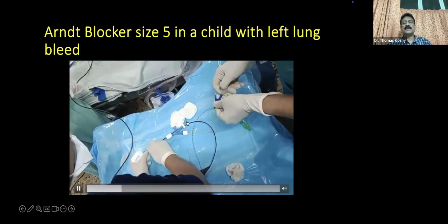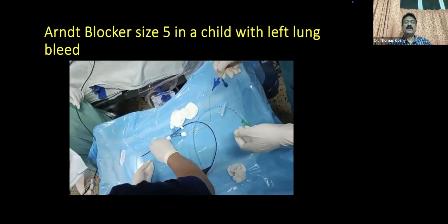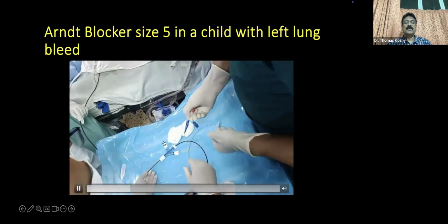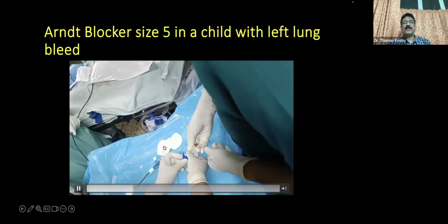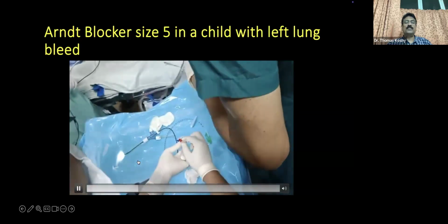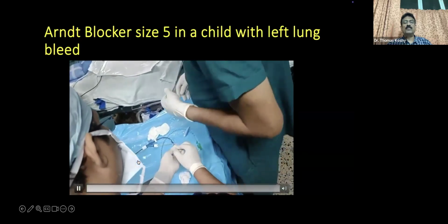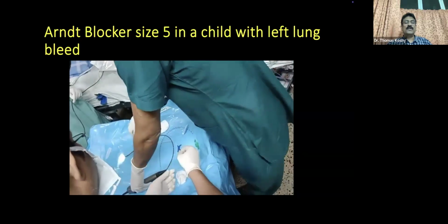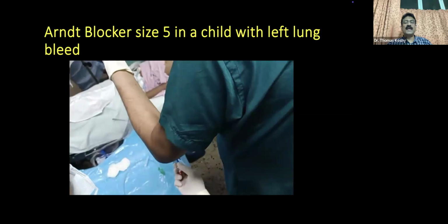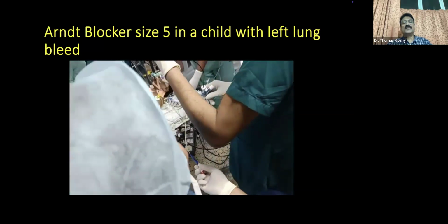This is the FOB, a size 2.8 FOB from Karl Storz. And this port is for connecting the circuit for ventilation. And that is a balloon. There is a wire loop tip. Through the wire loop, we will put the FOB and direct the balloon into the desired bronchus.